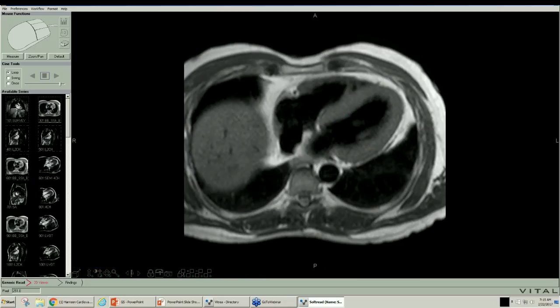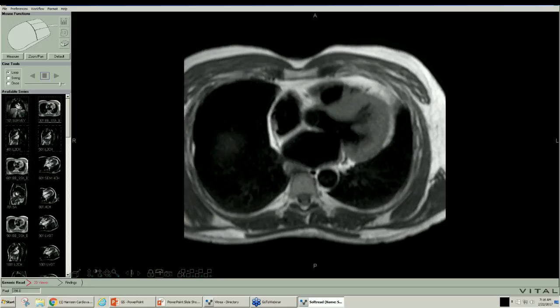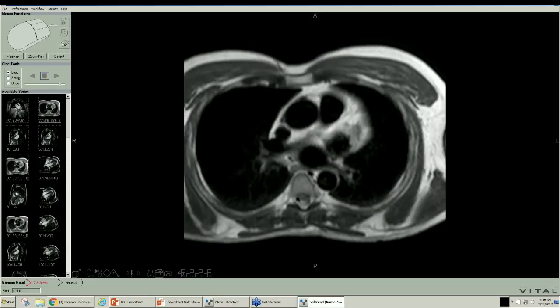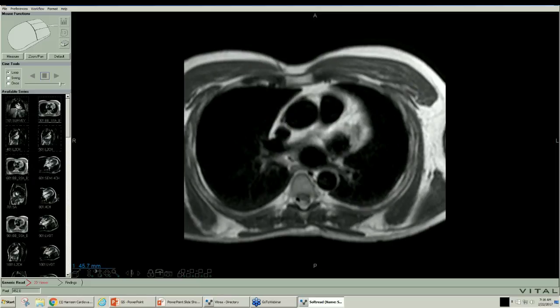You can see how that's normally thinned. Here's the right coronary. Here's the left anterior descending and circumflex, just to get some idea of what the coronaries look like. Right coronary is coming back towards the aorta here. Here's the left anterior descending, coming this way. This does not have a navigator, so we have not synchronized this with respiration, so you're going to see distortion of the coronaries from motion artifact from respiration. We do have a gate, though. But the gate we have is not a respiratory gate. It's a gate for the EKG.